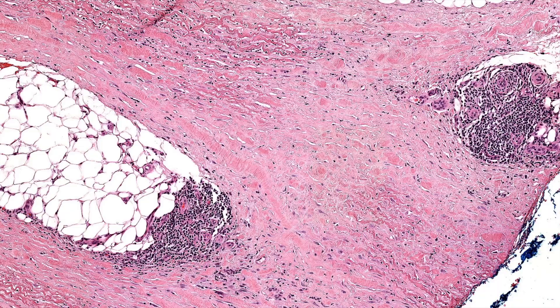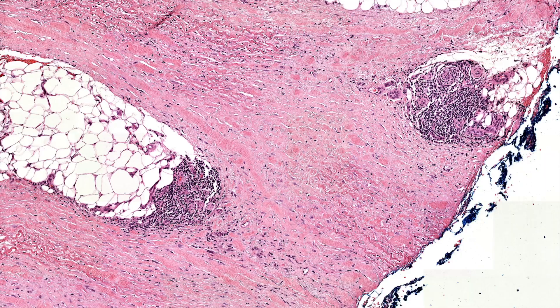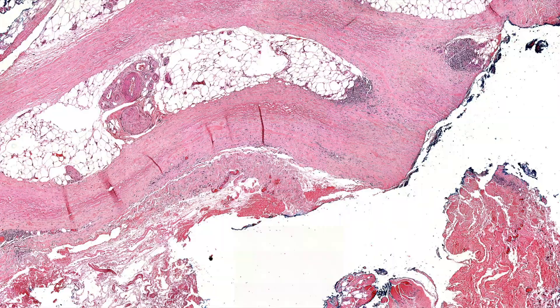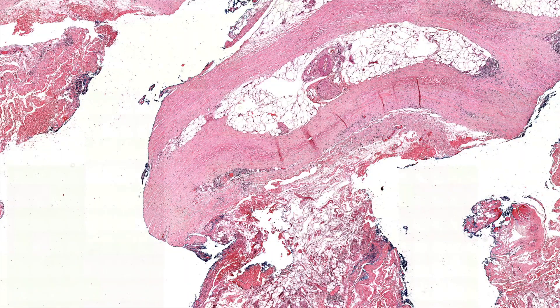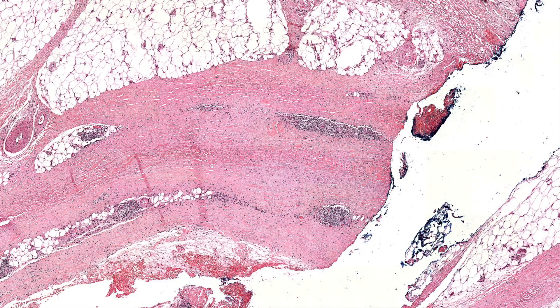You may get a little fibrin in here. You may get more inflammation in some cases. One case I saw had less inflammation than this — just like morphea, it can have more inflammation early on, and later on it burns out and it's just sclerotic collagen with less inflammation. It's a really interesting disease because it has a unique presentation and a pretty unique appearance.